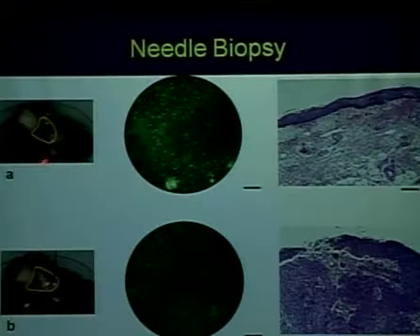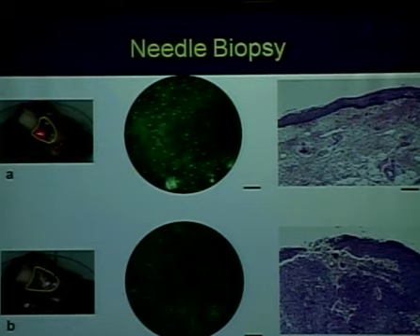Acriflavine binds nonspecifically to DNA, and so it makes the nuclei brightly fluorescent. And so in collaboration with Anne, here's a resected tumor from the oral cavity. We've done a topical application of acriflavine. The yellow line shows the clinical margin of the lesion, and here is the needle biopsy probe. And we're going to obtain an image here from a normal area and here from an area that was in the tumor.